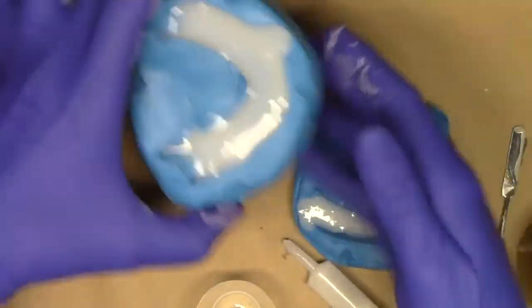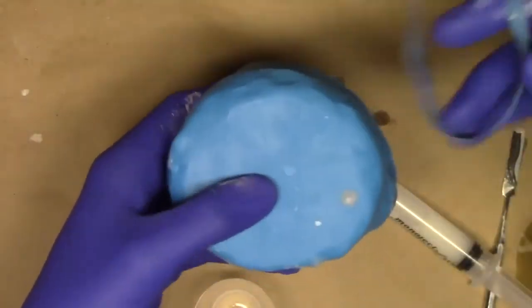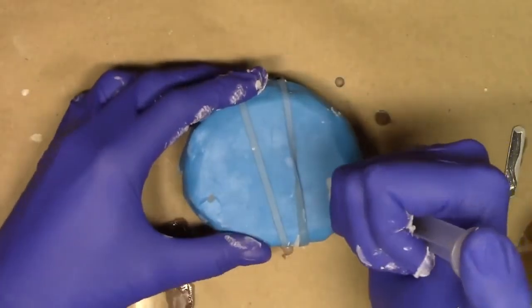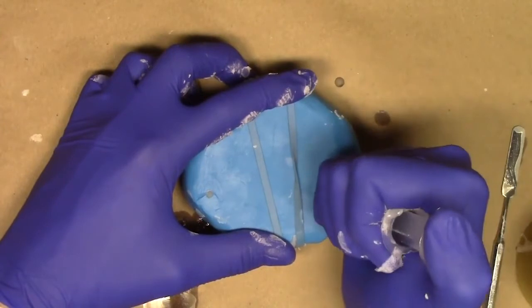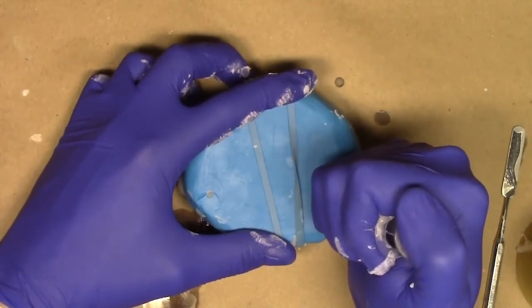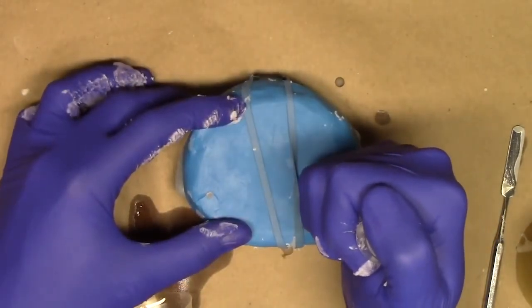What I like to do is just take my putty molds, combine them together, just like so. Put my rubber band on, and then just start injecting. I inject through the larger of the holes, verifying all of the material is in place, and many times I'll see the material start to come out the other hole as well, as it is right here. And sometimes it'll come out the sides. That's not a big deal.